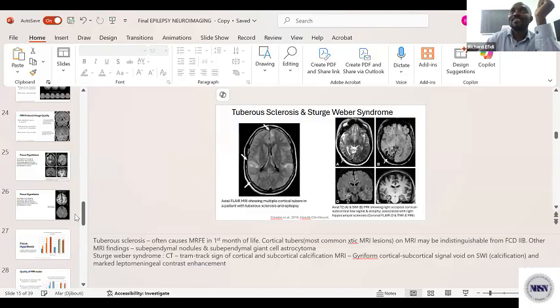That is the conventional axis of acquisition, which the radiographers are familiar with based on their training. Now, the hippocampal axis is another axis different from this conventional axis. In this case, it is acquired along the long axis of the hippocampus itself, and this is necessary for ease of detection of hippocampal sclerosis.